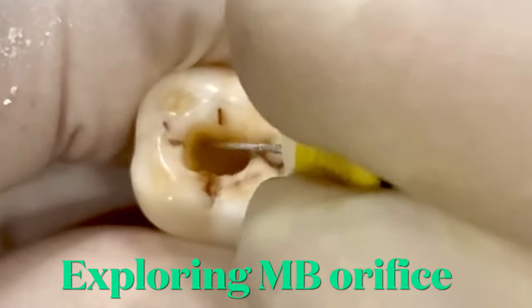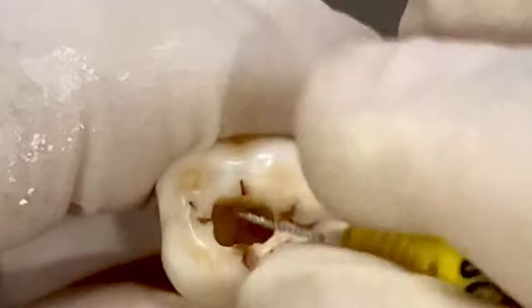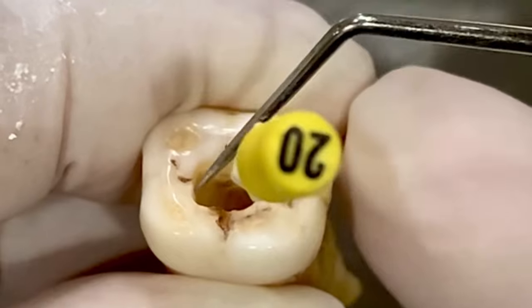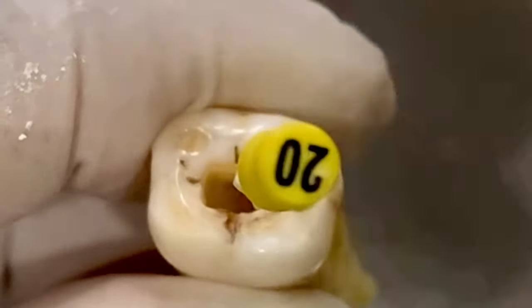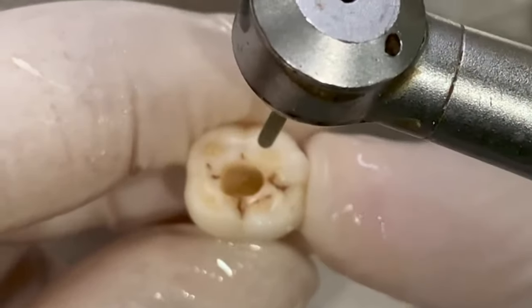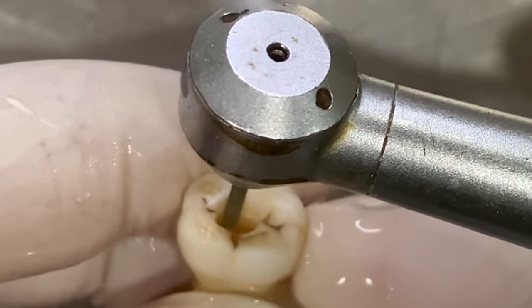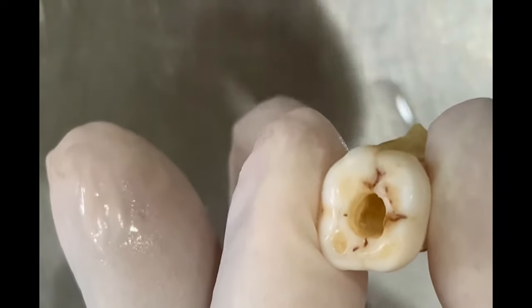We will explore the mesiobuccal orifice now. With the help of our file, slowly I will enter with a to-and-fro motion. Here we can have entered the canal, but this is an overhanging tooth which is causing obstruction, so we need to extend the cavity more on the mesiobuccal side such that we can have easy access. After widening the access cavity, I have taken some glide.